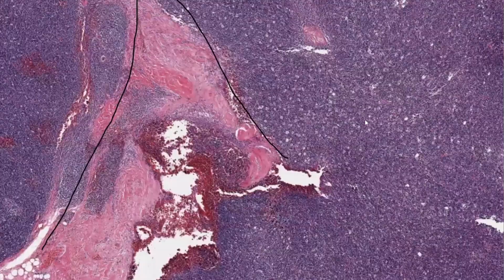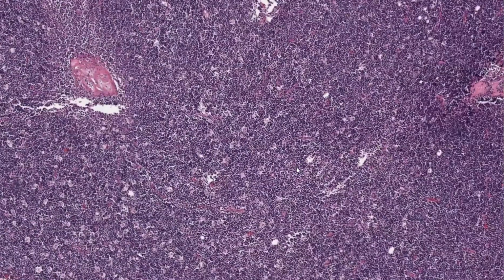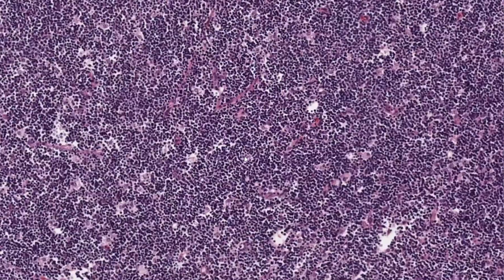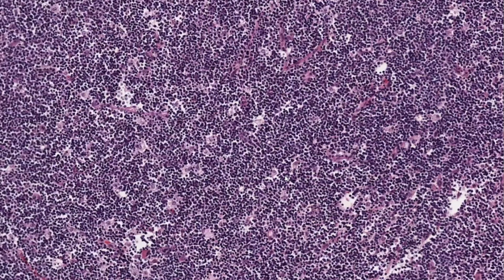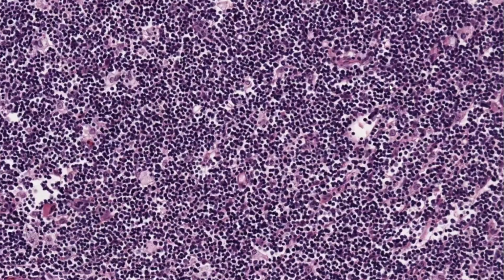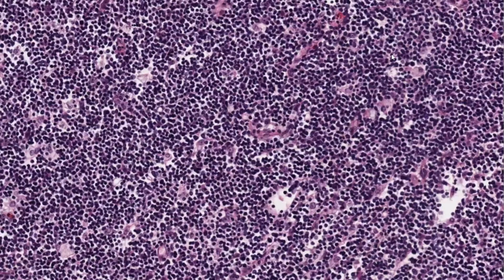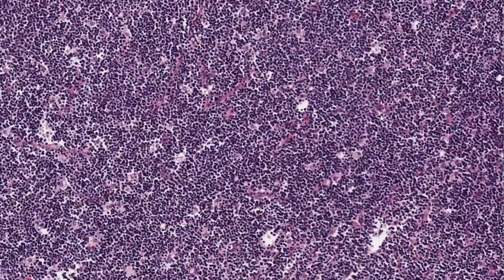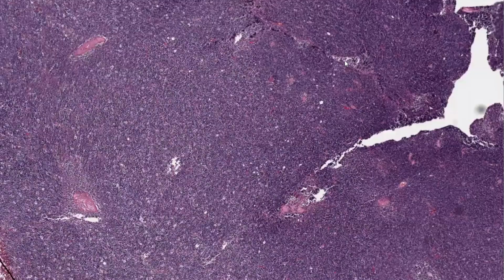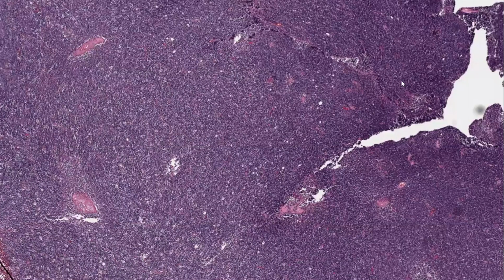And then in terms of thymomas, we subtype them in the WHO system into A and B thymomas. So this is a B thymoma as we have numerous of these lymphocytes and these interspersed epithelioid cells here. And this would be a B1 because we just see these single interspersed epithelioid cells, and we're not really seeing clusters or sheets of the epithelioid cells as we would see in a B2 or a B3 thymoma. And also there's some preserved areas of more medullary differentiation that is seen typically in B1 thymomas.